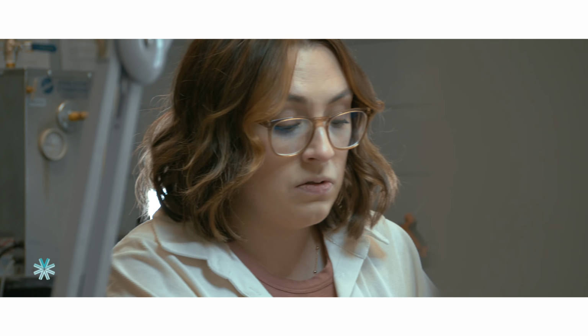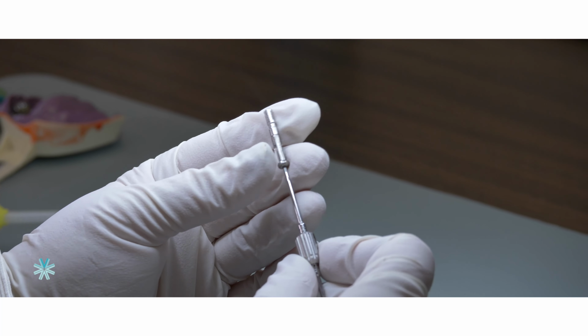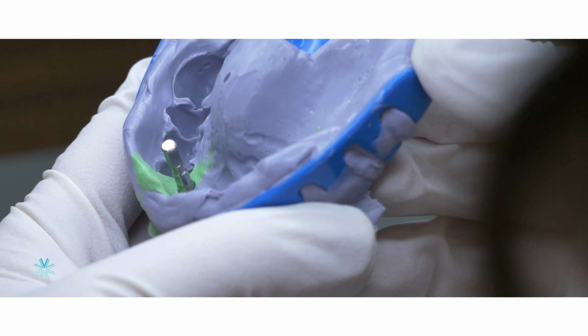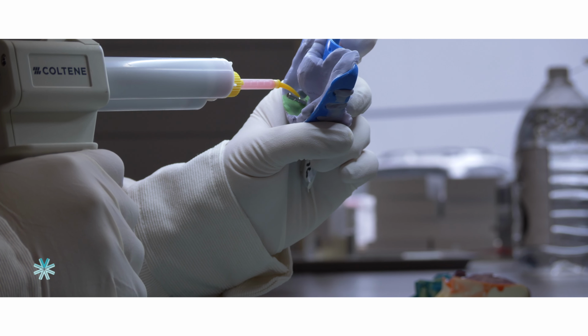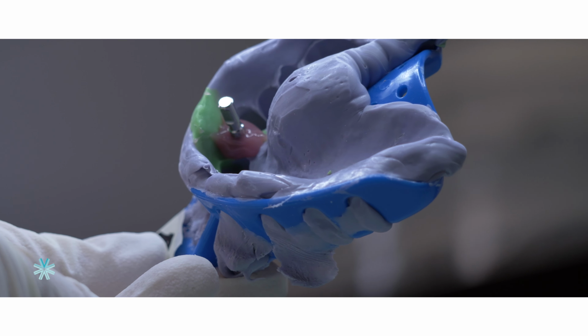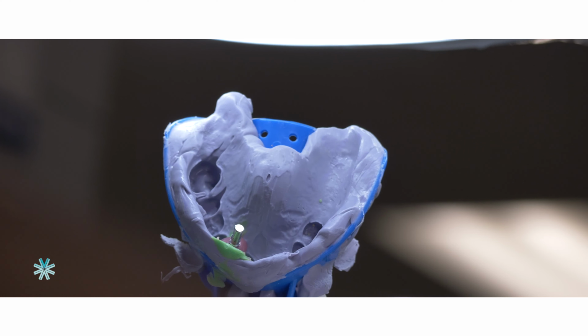The first thing I do is make sure that we have the right lab analog based off the implant system, and once that is screwed in and in place, I get our soft tissue gun and squeeze out as much soft tissue material as I need to go up to the base of the analog. So we're not going to see any of the impression coping that might be sticking out.